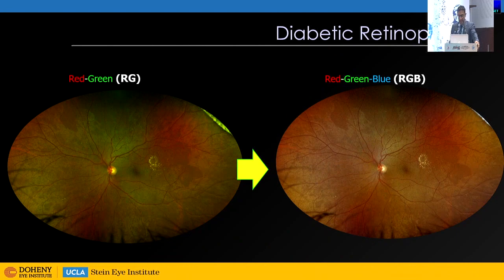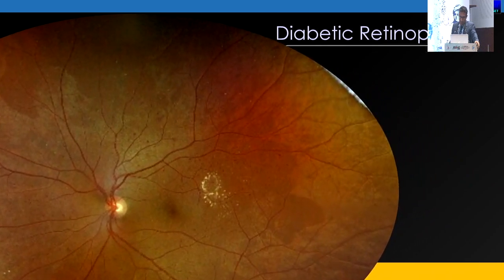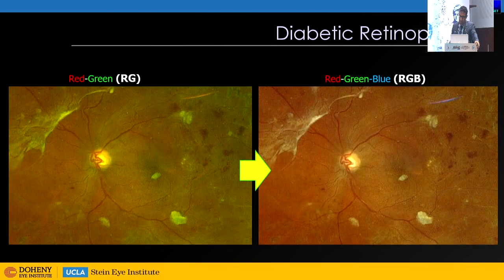Diabetic retinopathy, we already know there have been very nice studies that have shown that Optos, the pseudocolor imaging, Dr. Rajiv has been involved in many of those, can do a good job of grading the severity of the retinopathy. And so I don't think it's because we were missing those lesions. We see them just fine. It's just that everything, again, in terms of the coloration is rendered in the way that we might expect. More examples of patients with diabetic retinopathy. One thing I will highlight again is when you have fibrous proliferation in these patients, again, you can see the difference in the coloration, right?